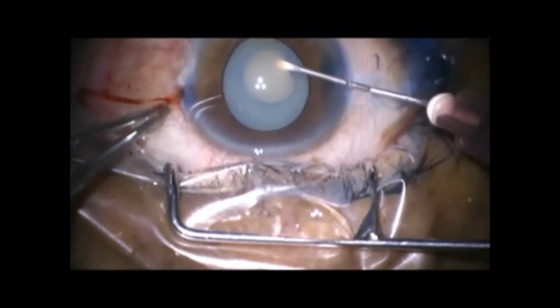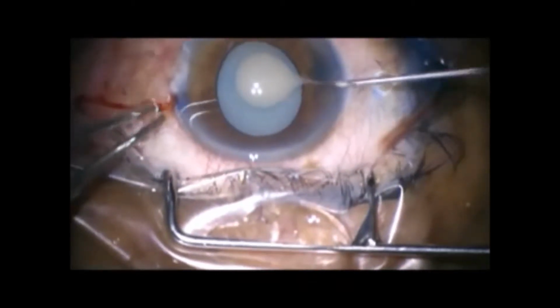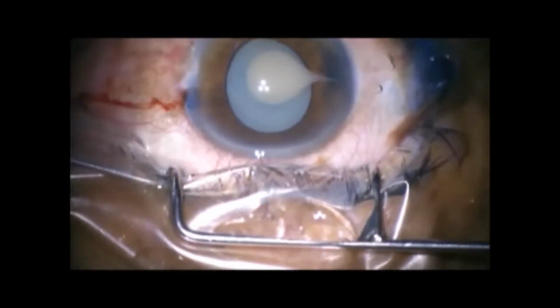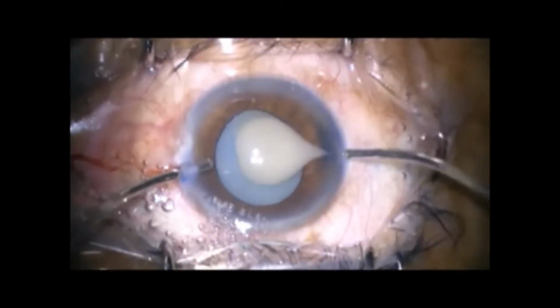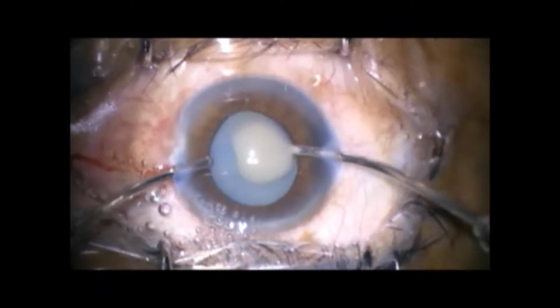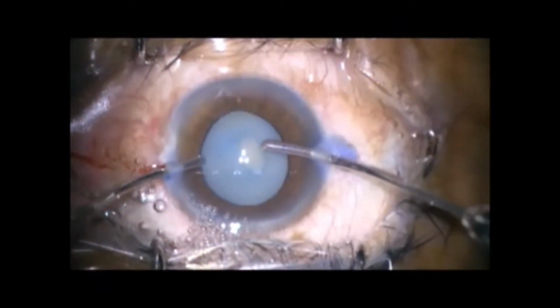We can see the liquid cortex oozing out of the capsular bag, obscuring the visualization. Now we introduce irrigation and aspiration cannulae through the 2 side ports. The oozing liquid cortex is aspirated using the aspiration cannula.